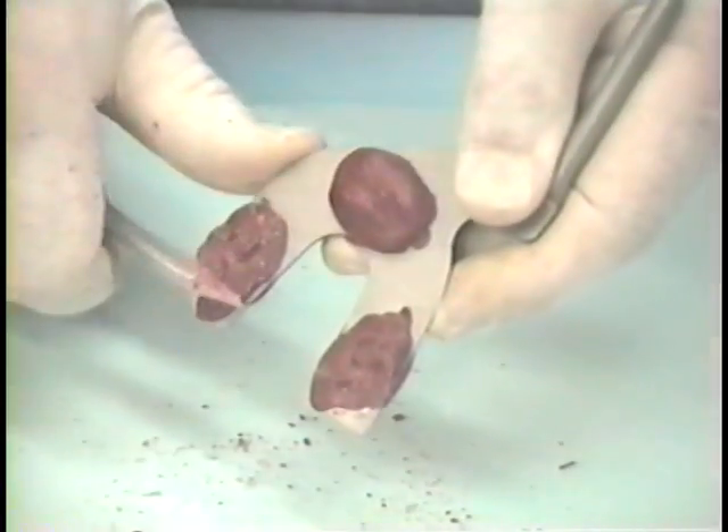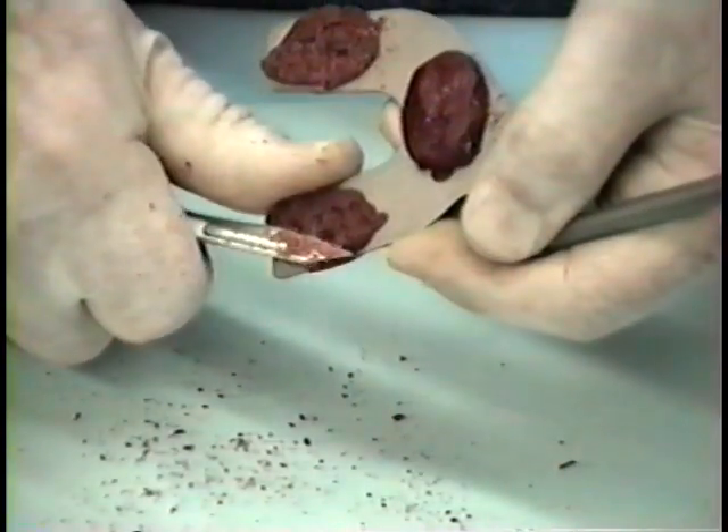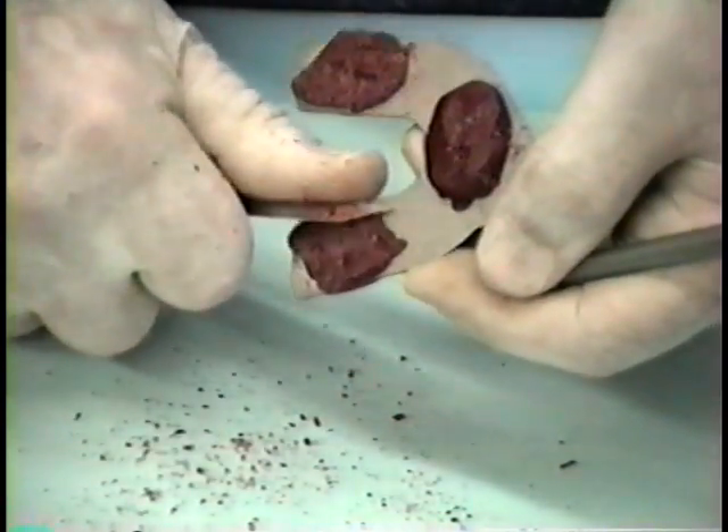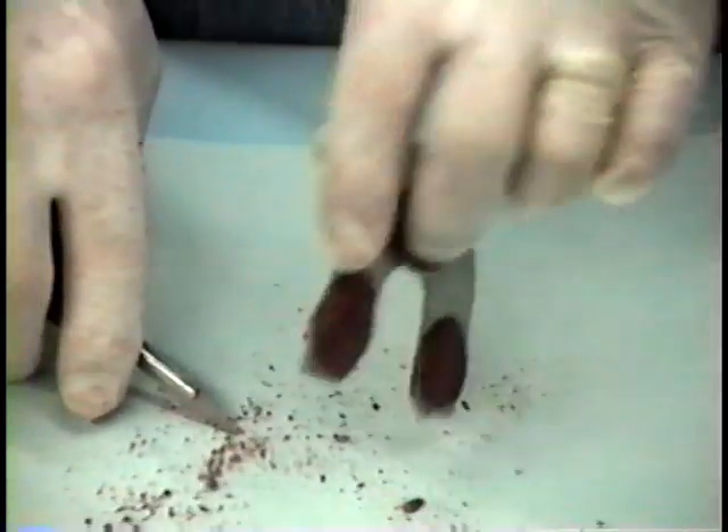Cut back excess compound with a sharp Bard Parker knife, leaving no more than one millimeter impressions of teeth. Also cut back distal extension edentulous areas, leaving only the area of ridge with dense attached gingiva.